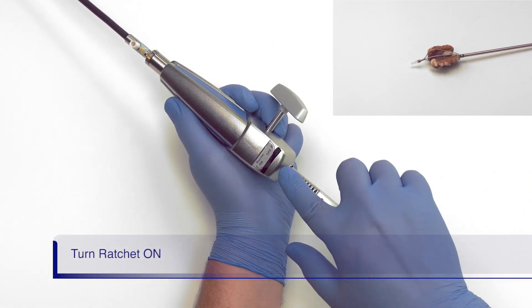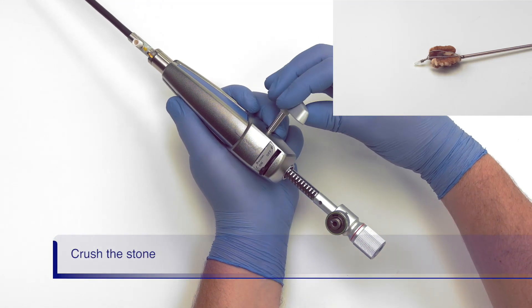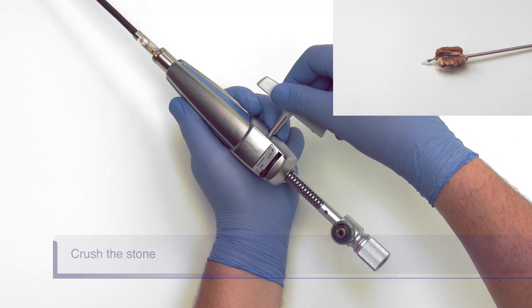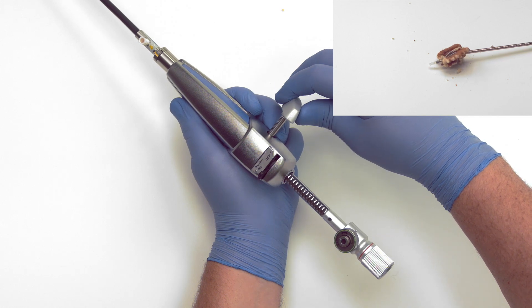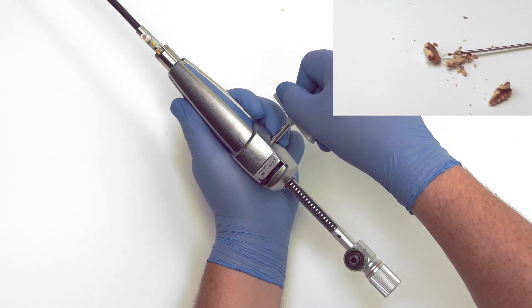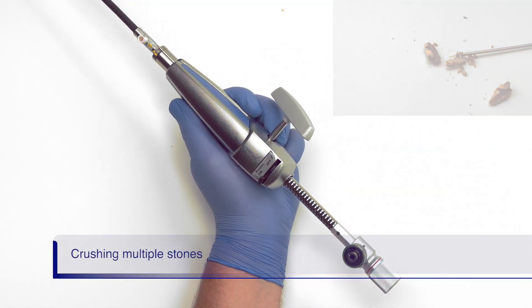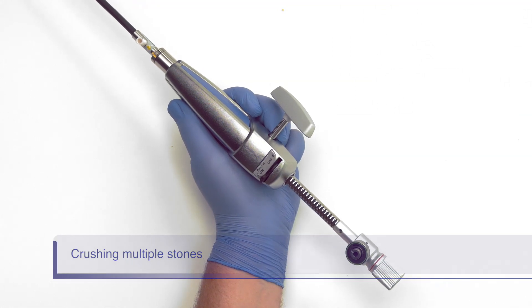Push the ratchet switch into the on position. Slowly turn the handle to close the basket around the stone and eventually crush the stone. It is important to turn no faster than demonstrated here, or the stone can slip out of the basket. Lithicrush V can be used to crush multiple stones; however, you will need to crush each stone one at a time.